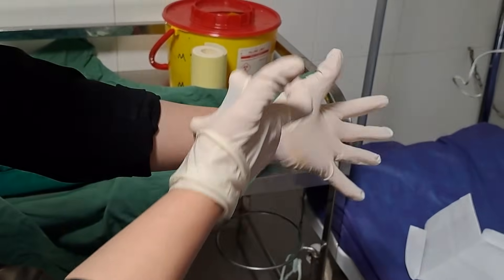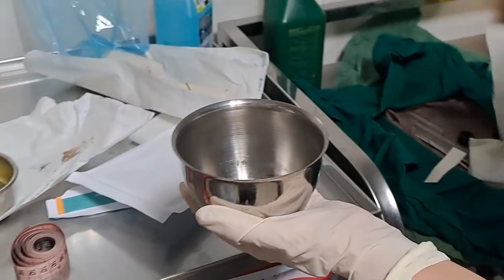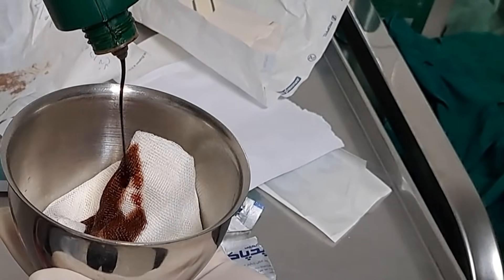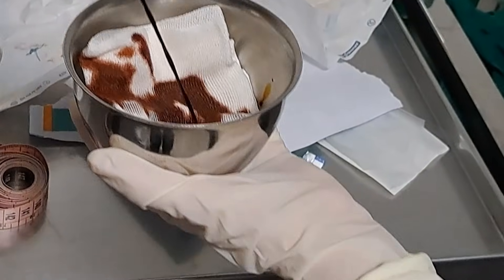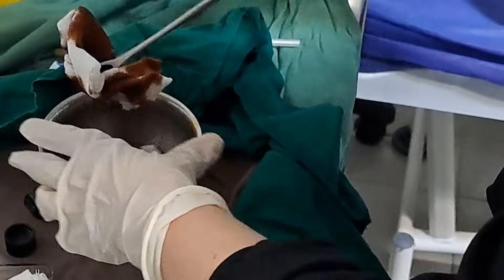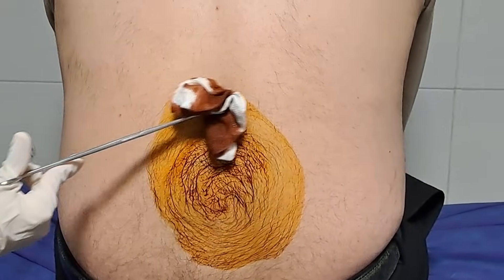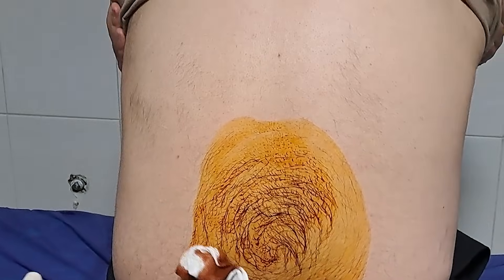First of all, the practitioner wears a pair of sterile gloves. The lower back should be sterilized using an antiseptic solution. Start cleaning at the injection site and move outward in concentric circles without returning to the previously cleaned area. This prevents recontamination of the cleaned site.